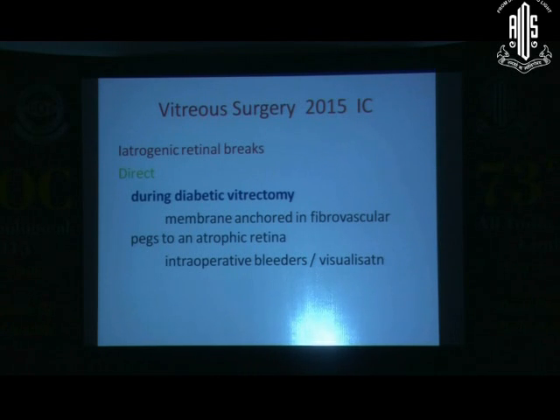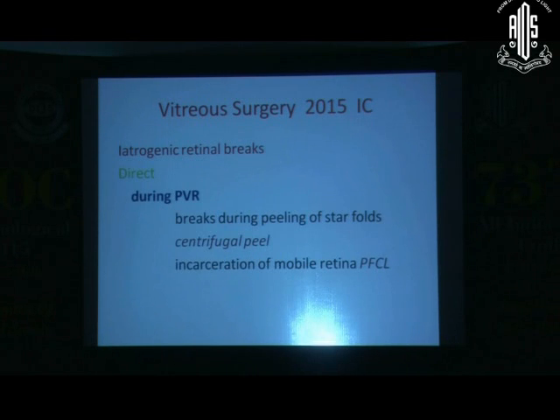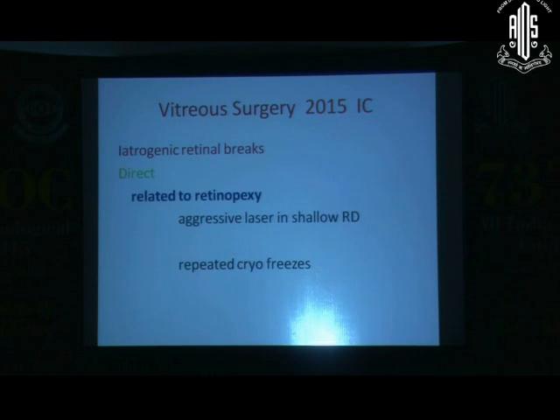so we have to be wary of what type of pathology we have, whether there is a focal point of anchorage or a broad attachment. Bleeding also may interfere and affect our surgery. During PVR, we should remember the posterior retina is thicker than the anterior retina, and peeling has to proceed from a posterior to anterior direction to prevent retinal breaks.